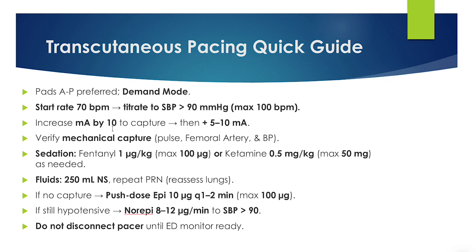If you're not getting capture though, you can increase the electricity. So the milliamps, we can increase it by 10 to get capture. So we can try, and titrate it up by 5 or 10 to verify capture. So capture includes two things, mechanical and electrical.